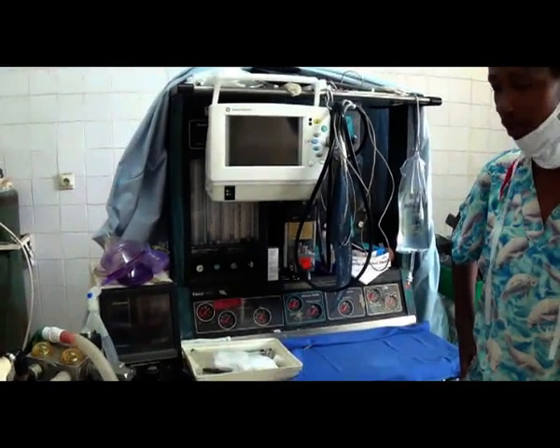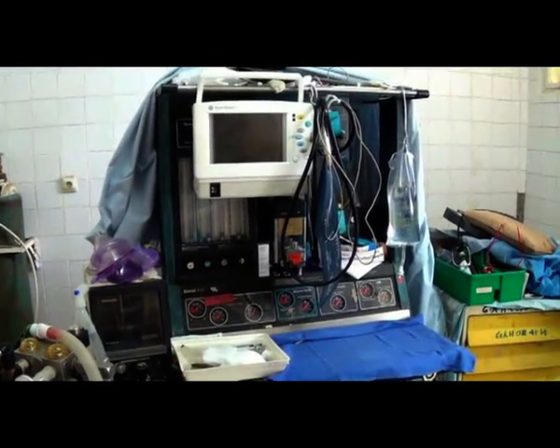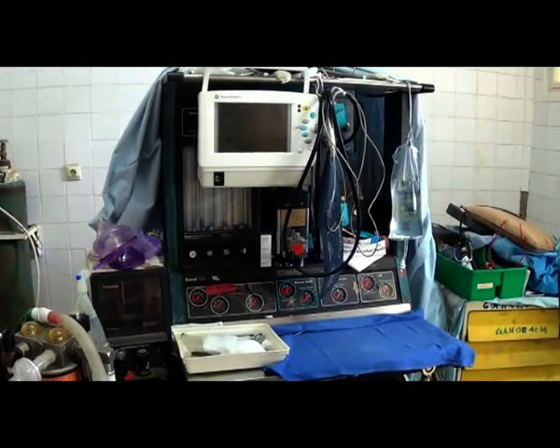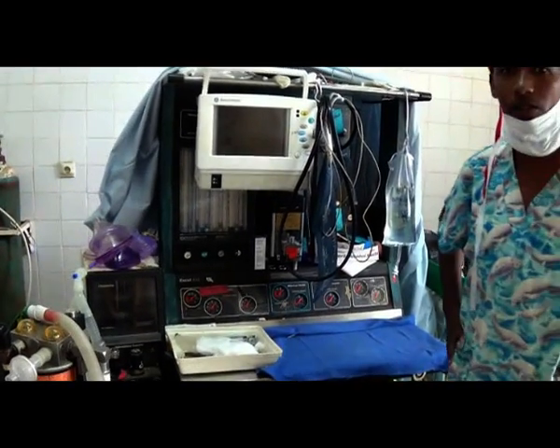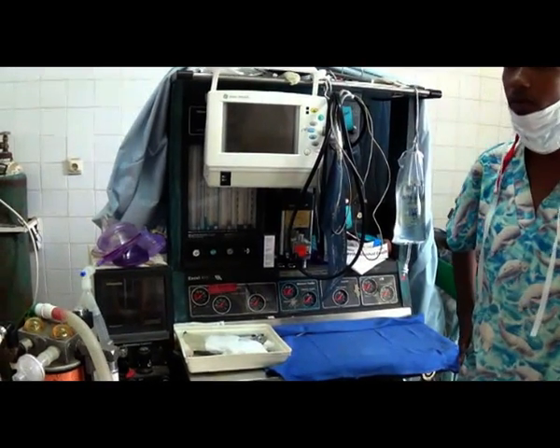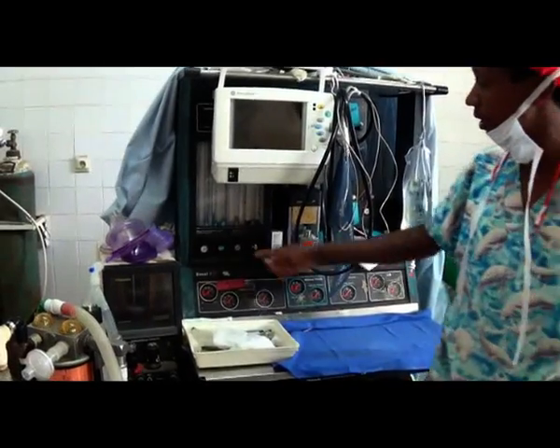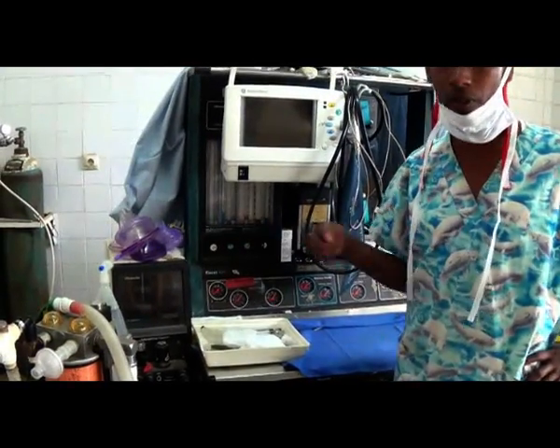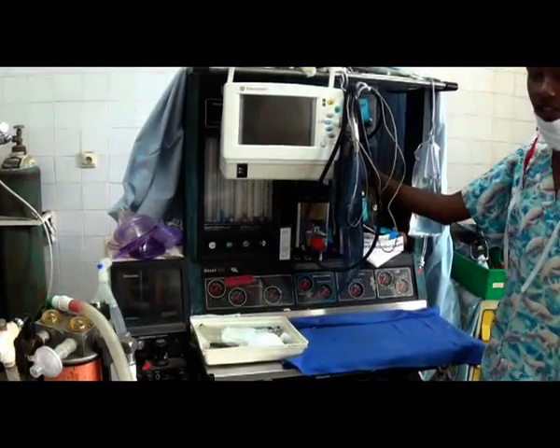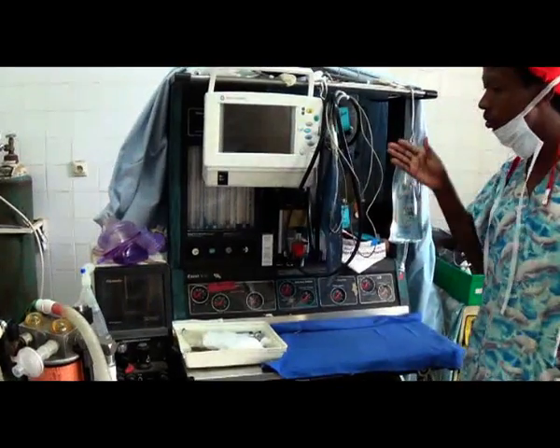Yeah, that is. And what I need to add here is that I am the only anesthetist who is familiar with this machine, because I prepared it here. If other new anesthetists or anyone else comes, they could not anesthetize the patient with this machine. I know how much oxygen percent I have to give for the patient because my machine has a leak. I know how many anesthetic agents or inhalational agents I need to give for my patients. It's not the normal dose.